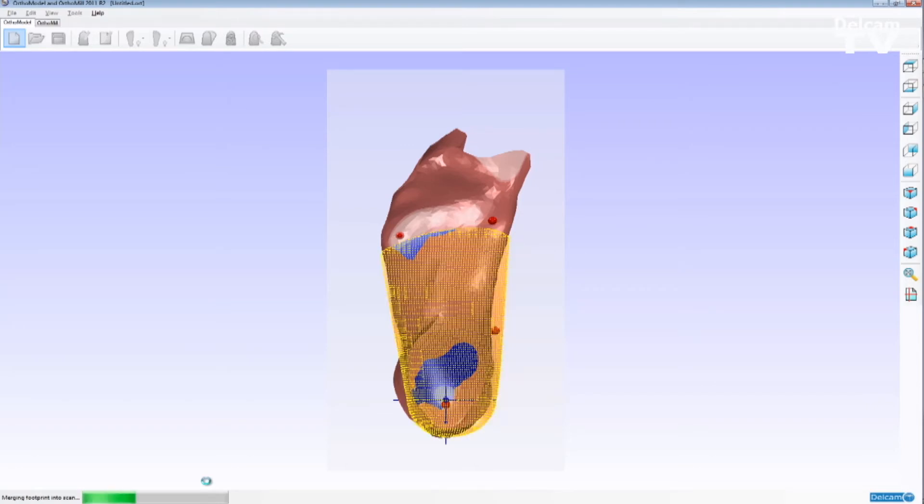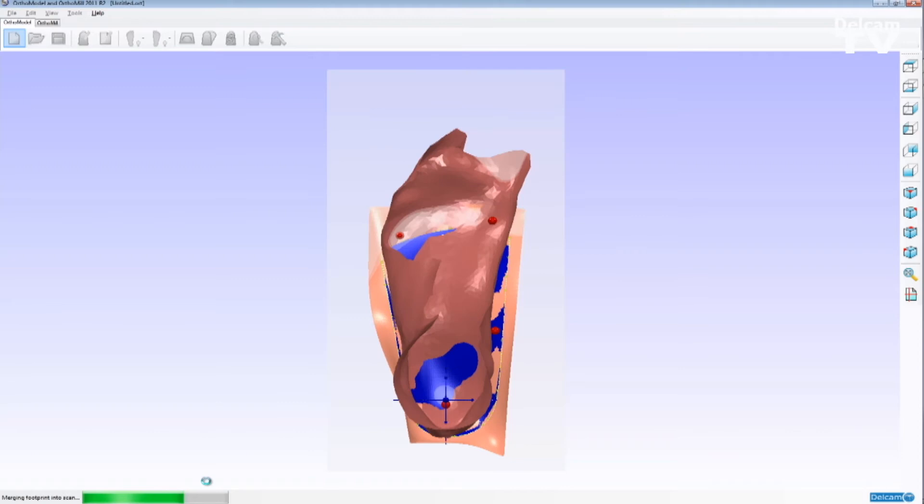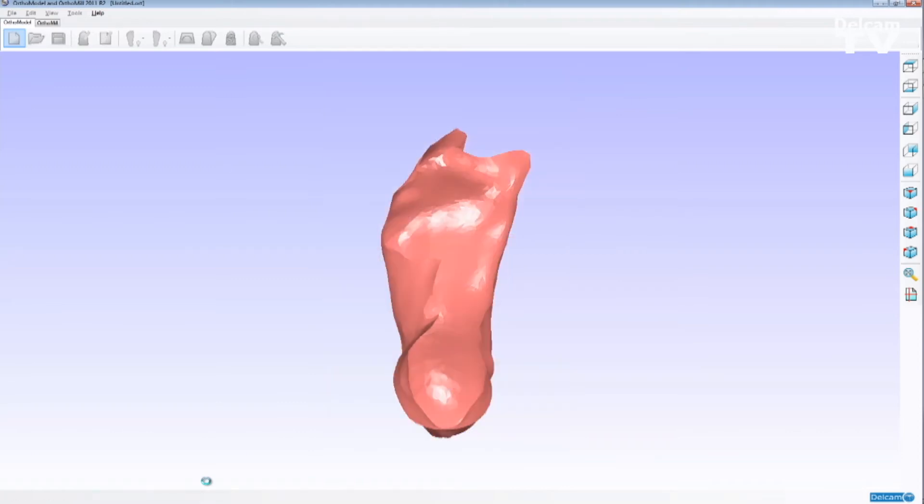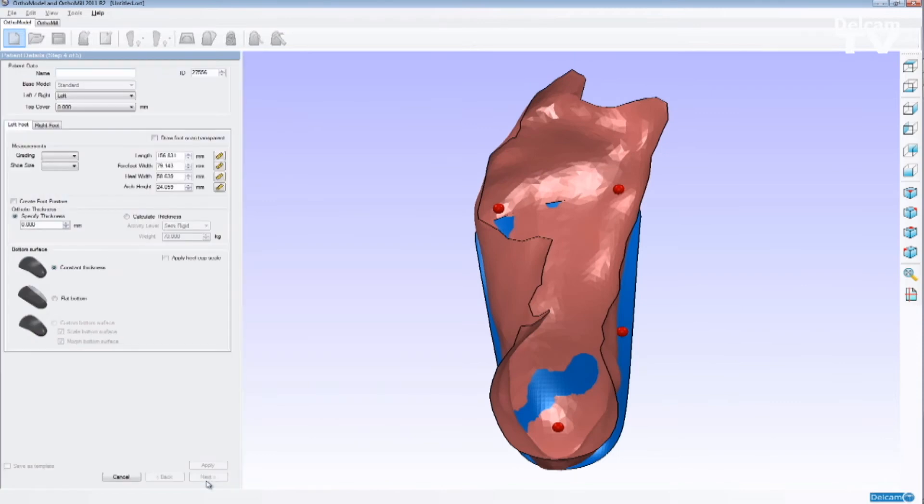For the purpose of this demonstration, I'm going to use the full contact approach, so OrthoModel now is going to apply all the modifications. It's going to guess the shape of the patient's foot, create an STL mesh based on the shape, and use the edge of the orthotic as a cookie cutter to trim out the shape for us automatically.